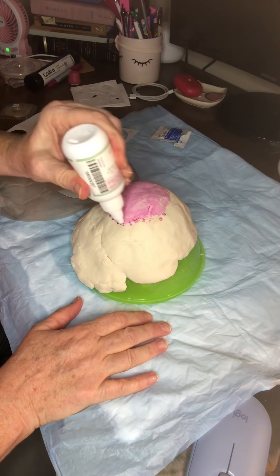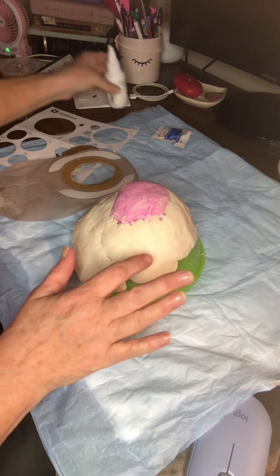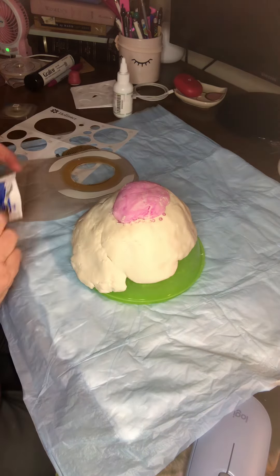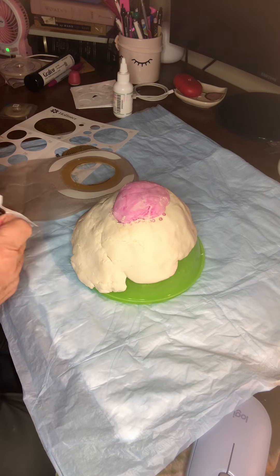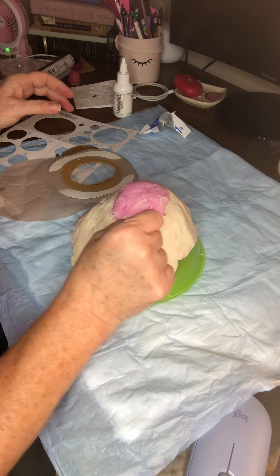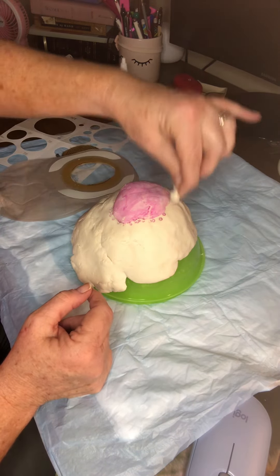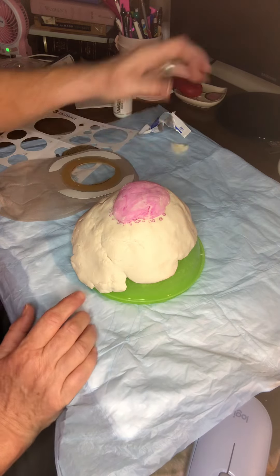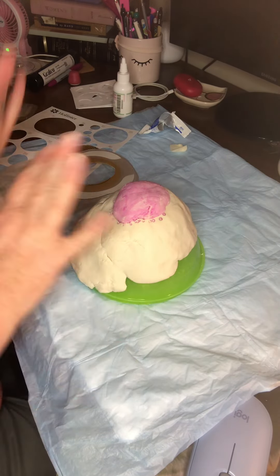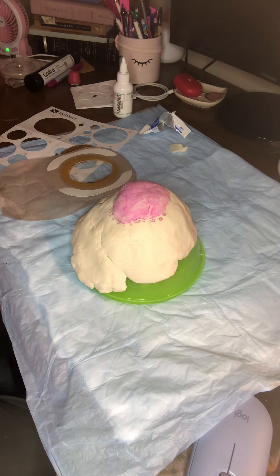Powder all these little areas here. It's best if you can get these silver nitrated in the clinic — that will help those little nodules to flatten back out. Spread the powder, then dab it with a little bit of barrier wipe all around the edges, making a little crust — that's why they call it crusting. Since I don't have any irritation up here, I'm not going to do anything there. Only crust or treat the skin if there is actually something to treat.